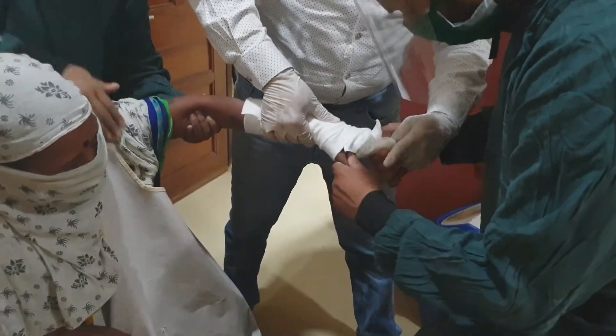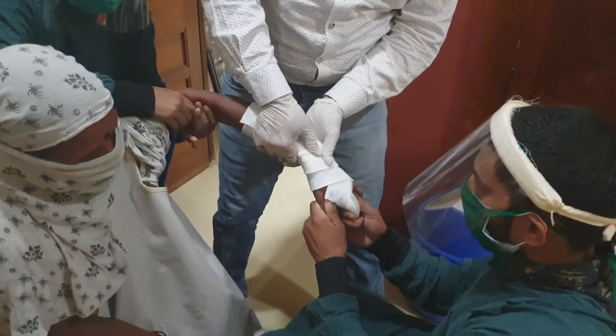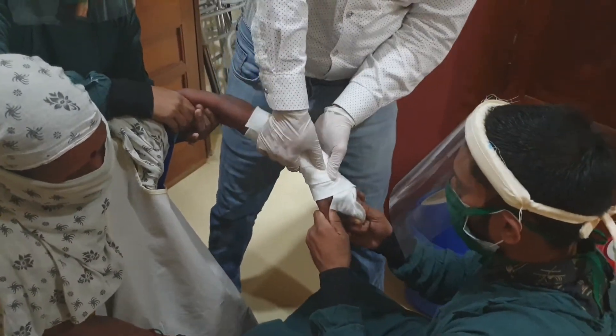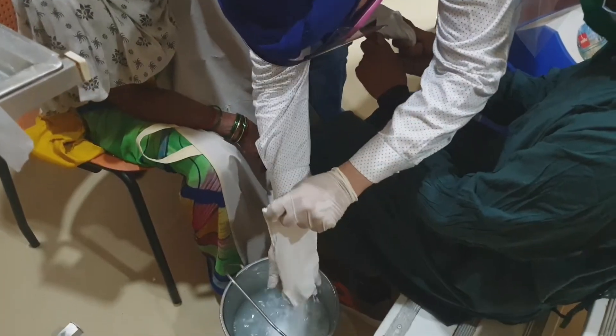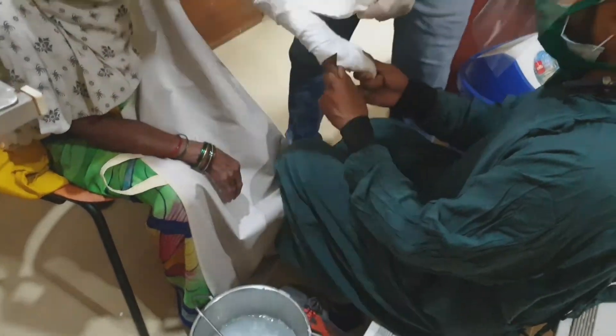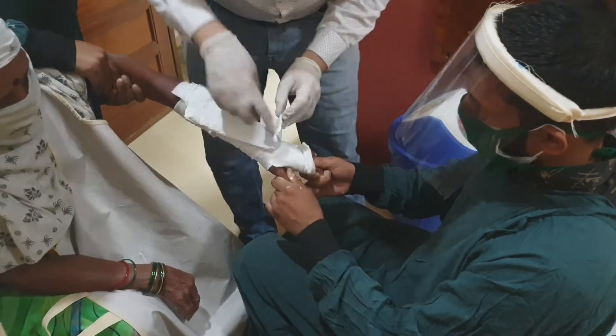With assistance, pull it and keep it reduced with traction and counter-traction, as well as pressure from the dorsal and volar directions. Since radial push is already present in the fracture, ulnar deviation and volar tilt help in maintaining the reduction.